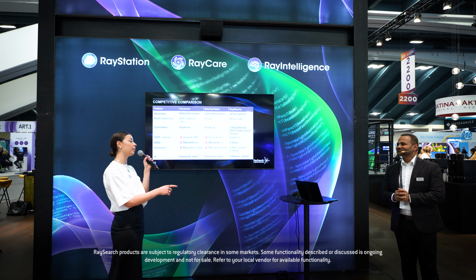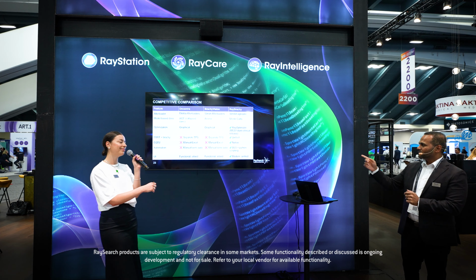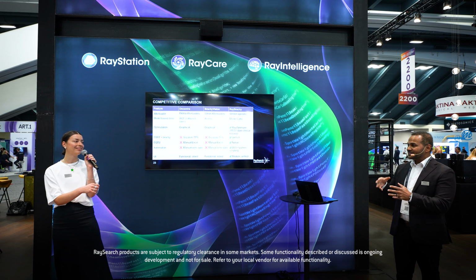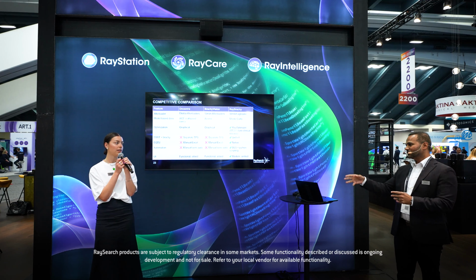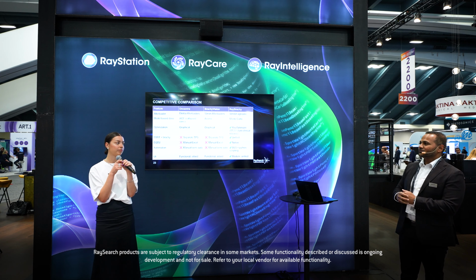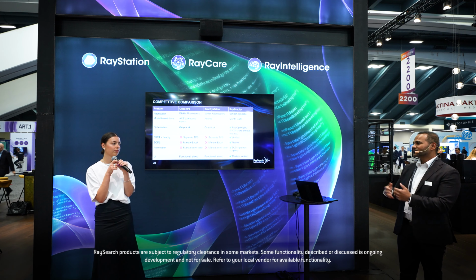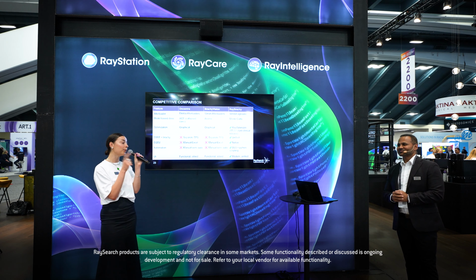You also mentioned something about EQD evaluation, right? Yes. One of the big things that's needed for brachy is to be able to sum the external beam along with the boost, which might be brachy. So we do that native to the application. Great. Well, we will talk more about that in the next talk. I know that for sure.